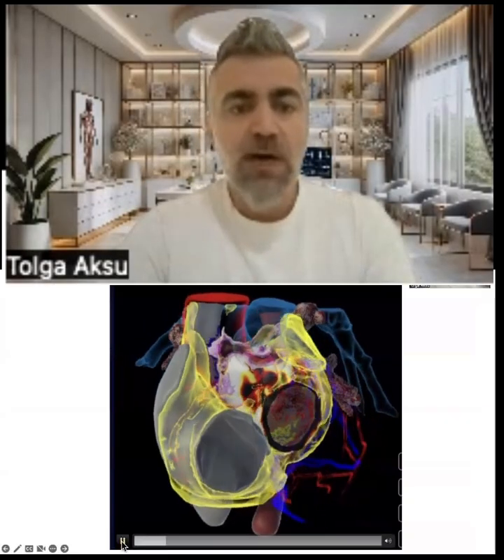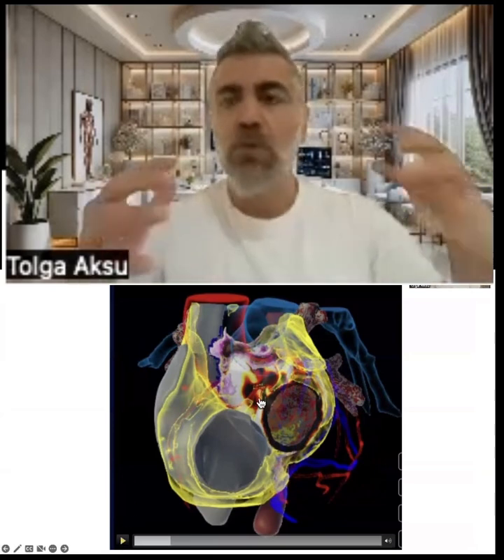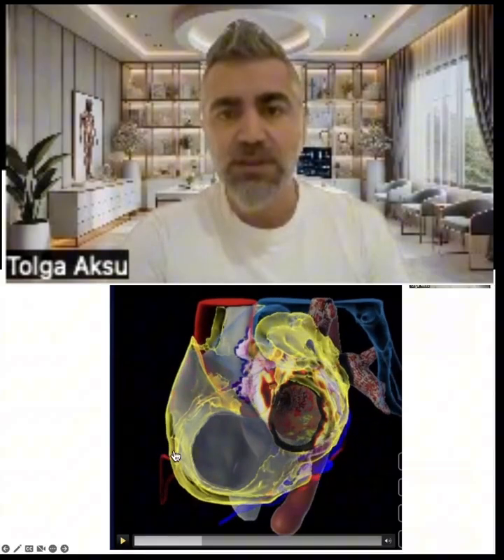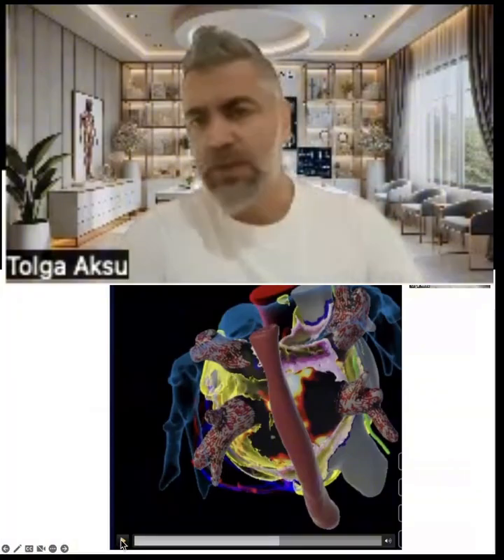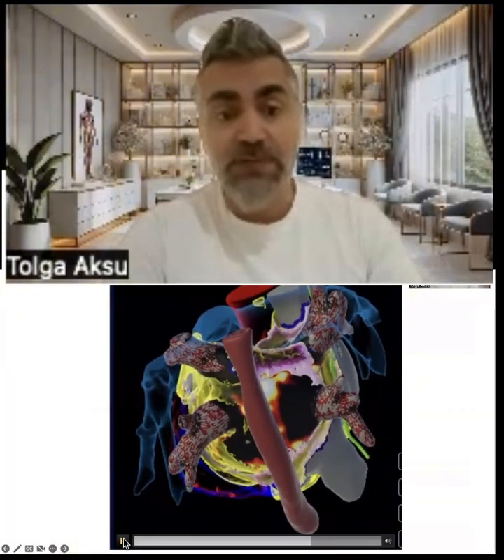So now I would like to say the new era in GP mapping, a combination of 3D CT and 3D map. Look at that. In this 3D CT image, this area shows epicardial fat pad, and we also see the location of esophagus, phrenic nerve, sinoatrial node artery, and other important areas during RF application.